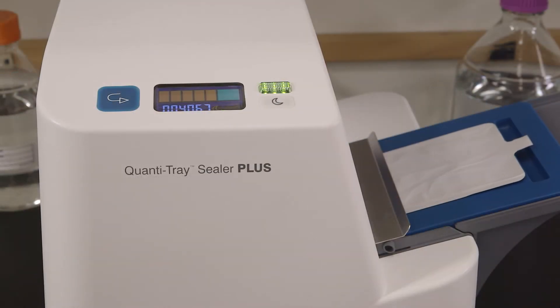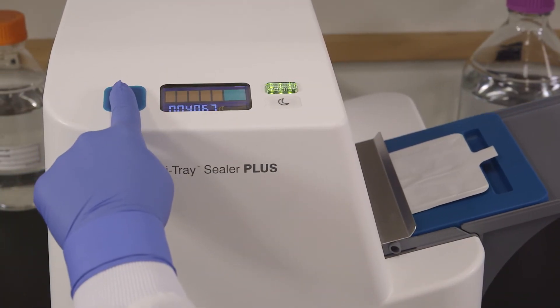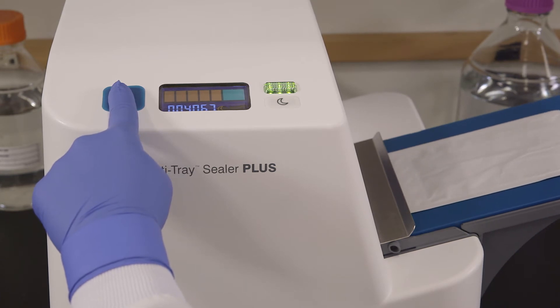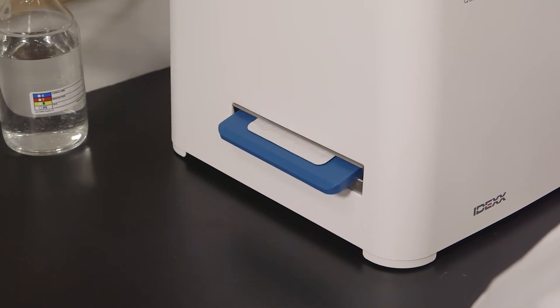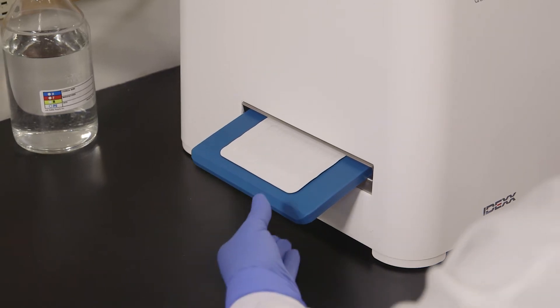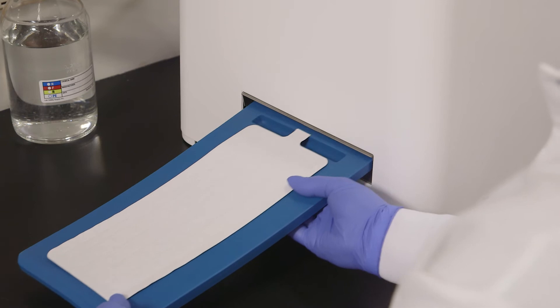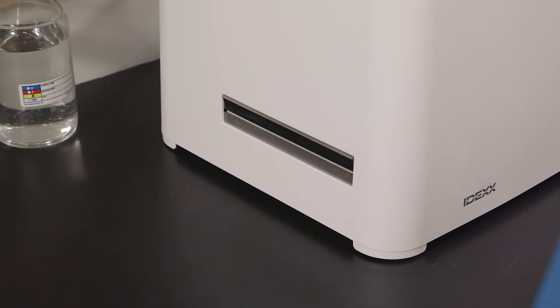If you need to reverse the motor press and hold the reverse button. However do not reverse the motor if the rubber insert is completely inside the sealer. The sealer distributes the sample mixture into the Quantitray wells, seals the wells and partially ejects the sealed tray. Remove the rubber insert and tray from the sealer.